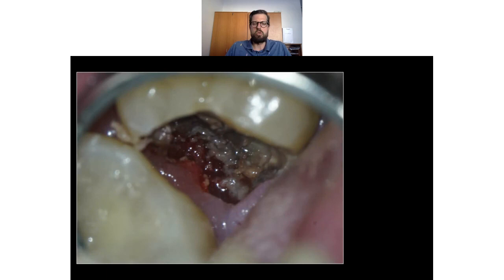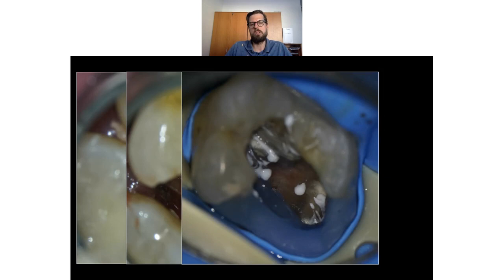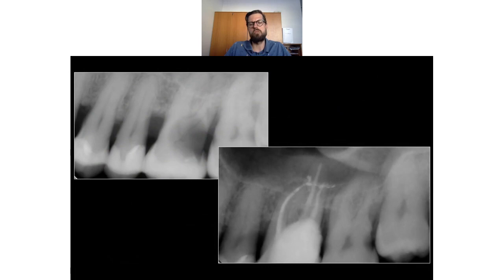You see it looks like this, and if you are cleaning it, you see that there's the bifurcation between the palatal and the distal buccal root. So there is a big problem. Normally, no way, you just take the forceps and take the tooth out, but this was not the case. The patient wanted it, so I did it freehand. I etched it all in one, and I put some blue flow down there so that I can continue with the endo. This was before and after. I managed to find the MB1 and MB2, but it's not important. But you see there's no reason that I should have continued, because there's an interproximal problem. So I cannot do a crown, I cannot do a normal filling. The tooth is there, but for how long, and what will happen with the second molar?